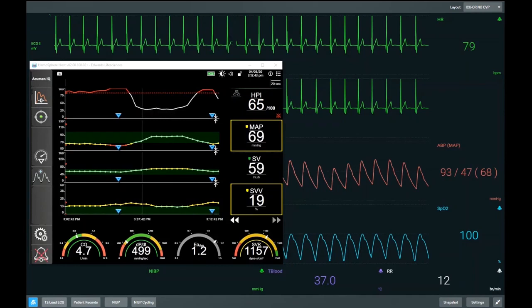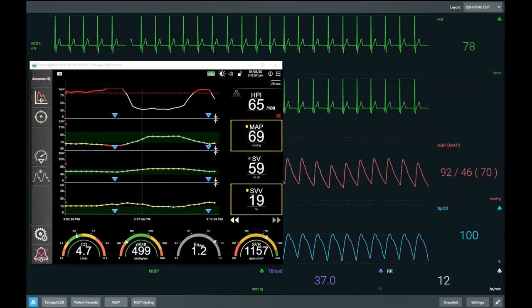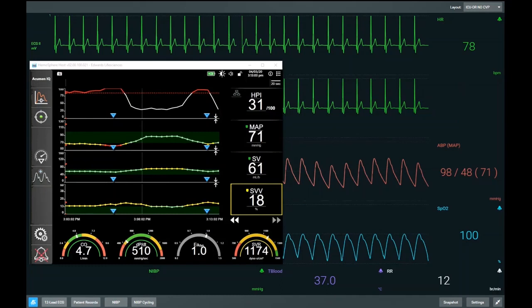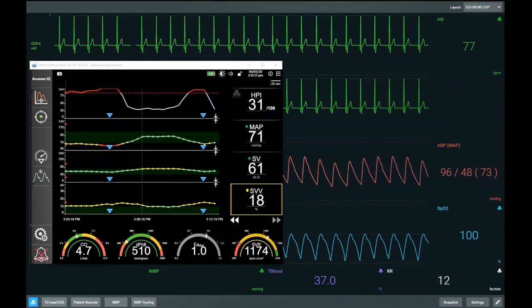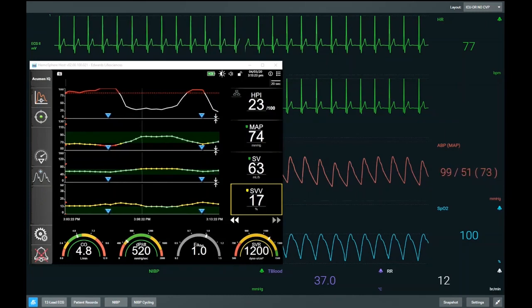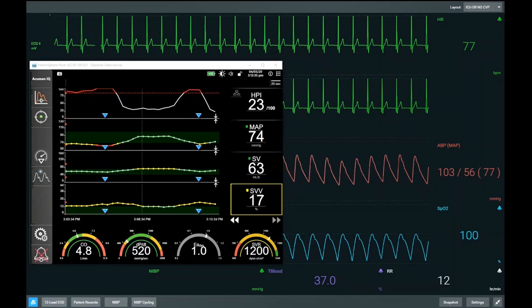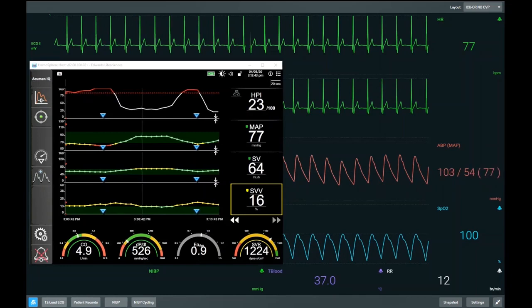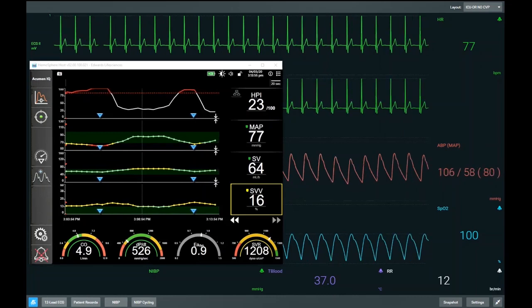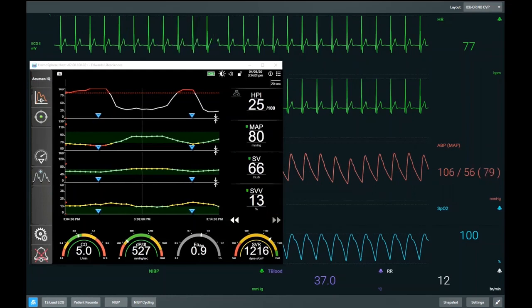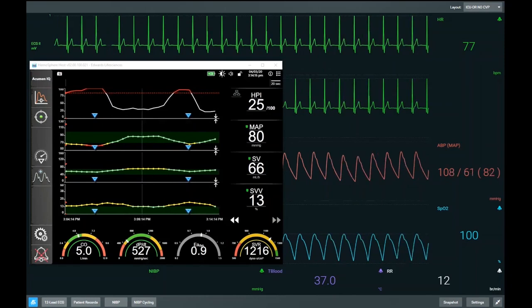So if we give this individual a fluid bolus — in this scenario, we are still not hypotensive, we've intervened before hypotension has occurred. By doing that, we've managed to avoid a hypotensive episode. HPI is now starting to decrease, our mean arterial pressure is on the rise, and our stroke volume is also starting to increase. The patient still remains preload responsive with SVV raised at 18, but as the fluid bolus continues to enter the circulation, that will continue to drop as stroke volume and pressure continue to rise. We've used HPI in the clinical context it's intended for — to give a warning of trending towards a hypotensive event and to intervene before that event occurs.